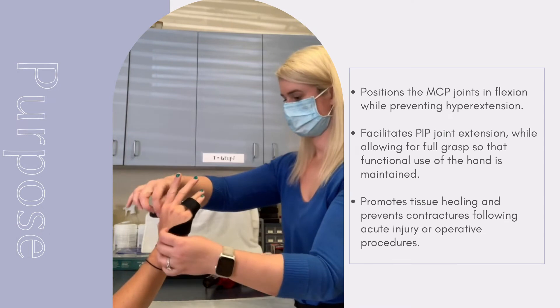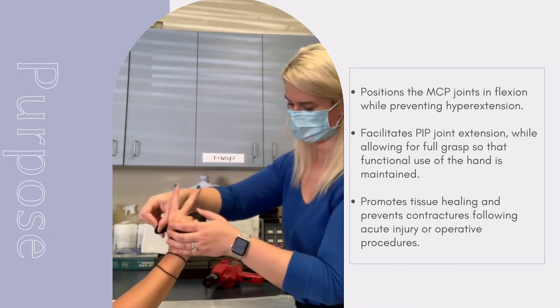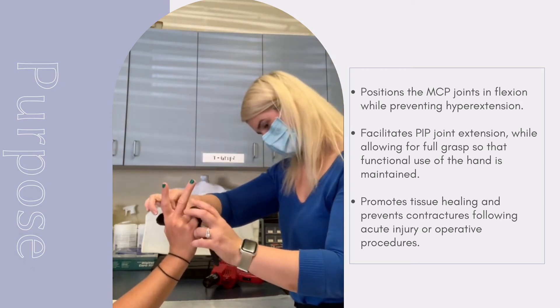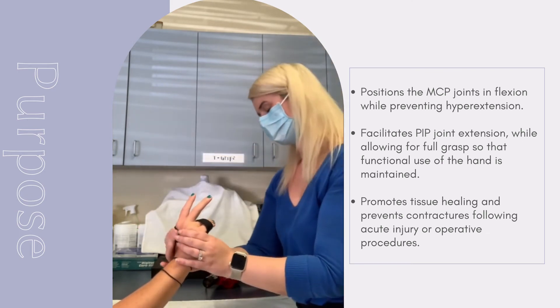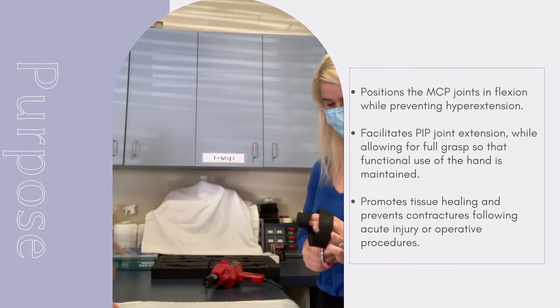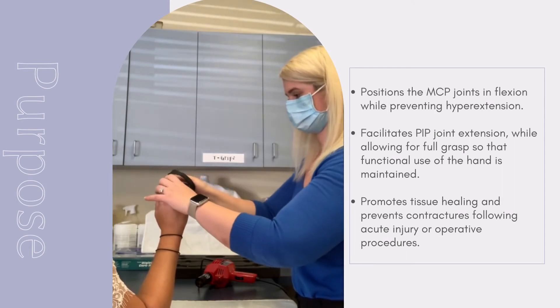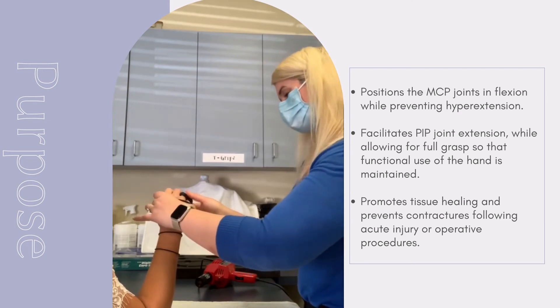The material can be reheated and reformed to the patient in order to create contours between the digits as well as the distal palm crease, and to ensure that the joints can move freely.